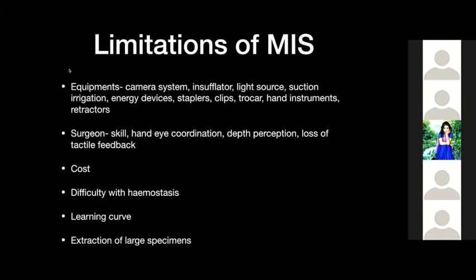So in terms of equipment, the camera system was the revolution. It changed the way a surgery was looked at. From the time in the 90s and the early 2000s, where people thought that this kind of surgery was absurd, to now embracing it and even becoming gold standard in many types of surgery. Insufflators technology has improved, light sources. So you need all these things, these are the basic devices you need to perform any kind.